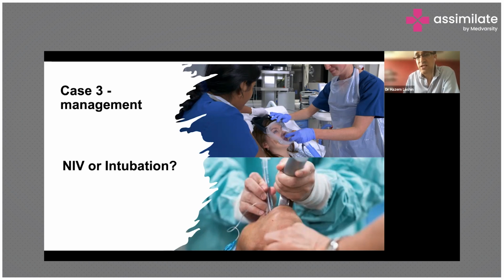If the patient's condition is really advanced and the CO2 retention is high and they're getting tired, then NIV may not be particularly useful in this case, and you would proceed to intubation. So there is no right and wrong answer here, and the guidelines also say that NIV could be used in this situation, but under specialist guidance. So basically, it tells you to do what you think is right, and I think this is the right approach, because there's no clear-cut right or wrong answer here.